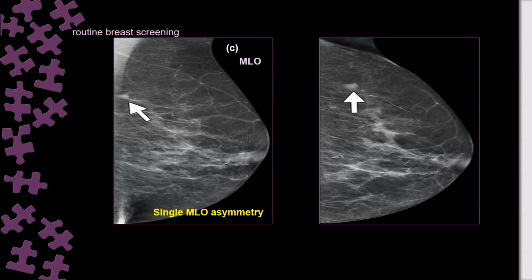This is a superficial part, a shallow portion of the breast, upper medial. When you make a compression, this shallow portion will usually be outside the field of view on the MLO. So this is the area usually deficient on MLO.